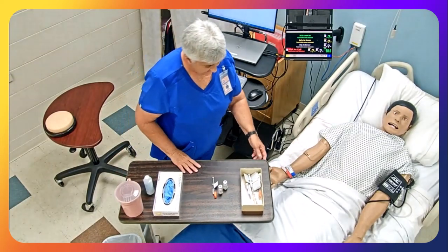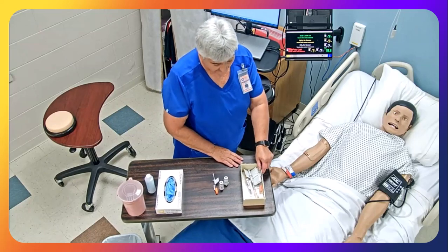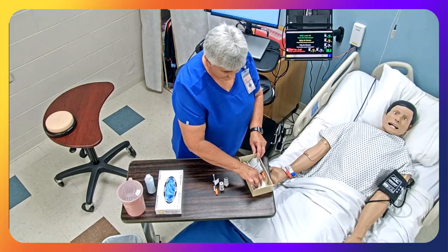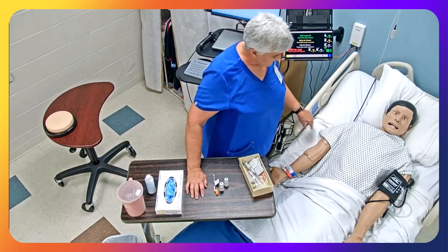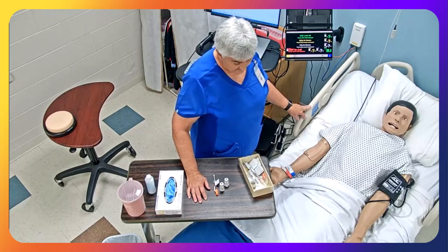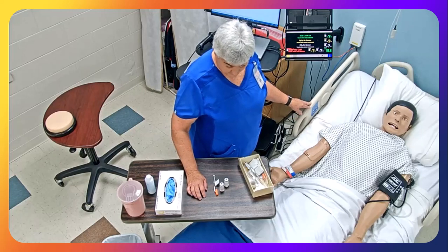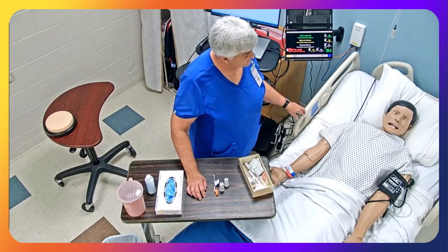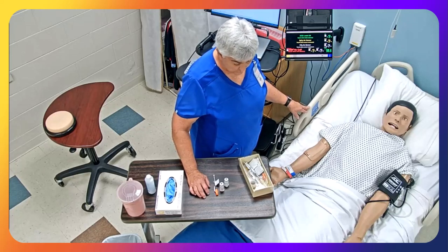Miss Taylor, so we are going to be giving you your insulin. It's regular insulin, and we also have our NPH insulin. So regular insulin is short-acting, and the NPH insulin is intermediate-acting. The onset for the regular insulin is 30 to 60 minutes, and the onset for the NPH is 1 to 2 hours.